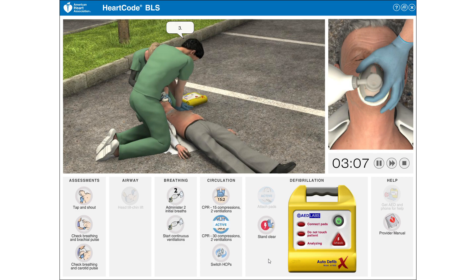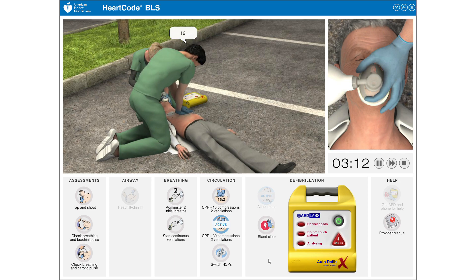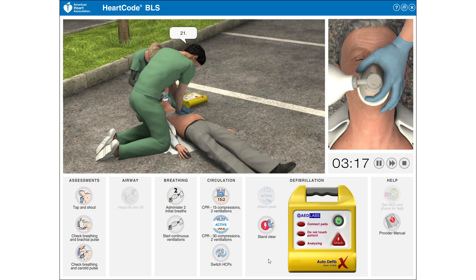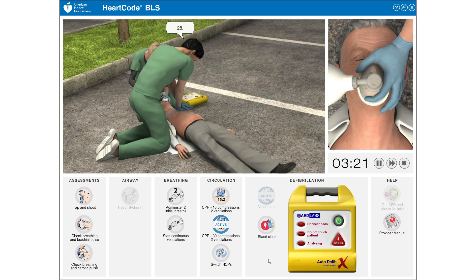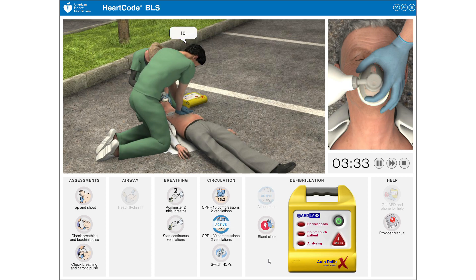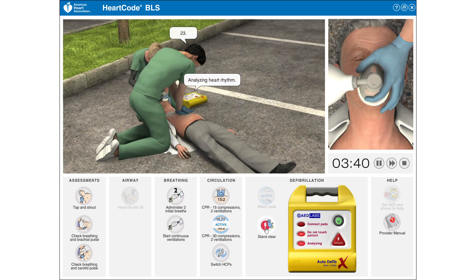1, 2, 3, 4, 5, 6, 27, 28, 29, 30. [rescue breaths] 1, 2, 3, 4, 5, 6, 30. 9, 10, 11, 12, 13, 14, 15, 16, 17, 18, 19, 20, 21, 22, 23, 24. Stand clear of patient.